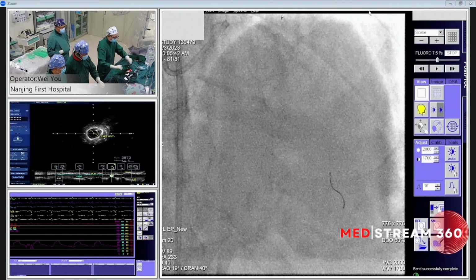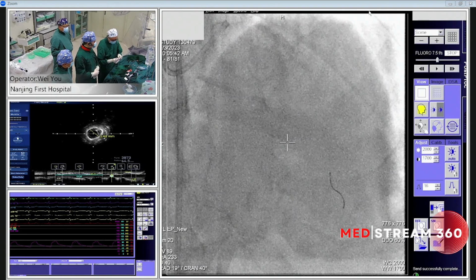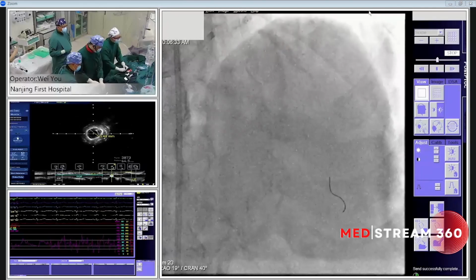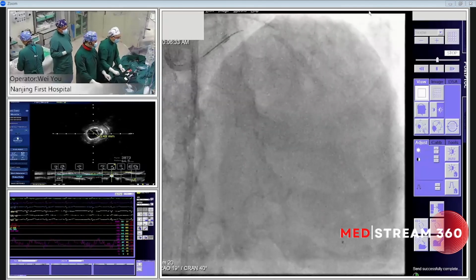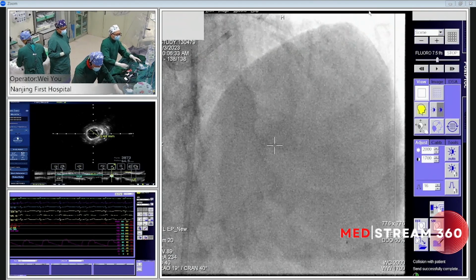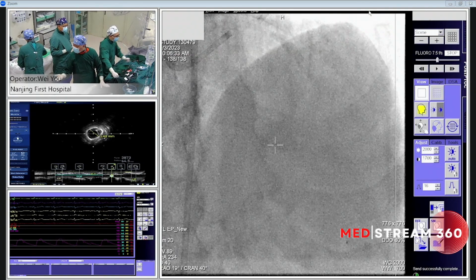For this scenario, considering very long lesions, will you use only a workhorse wire or some stiffer support wire? Okay, support may be better because after all it's a long lesion with angulation. Extra support wire, please. Considering it's an elderly patient, an 80-year-old gentleman, and also the eGFR is only 60, so I think it's CKD stage 2 to 3, we should save the contrast medium. This is why we choose IVUS guided, not OCT guided. Yeah, that's a very important point.